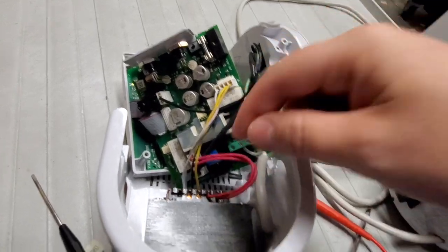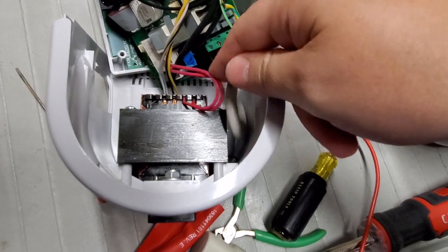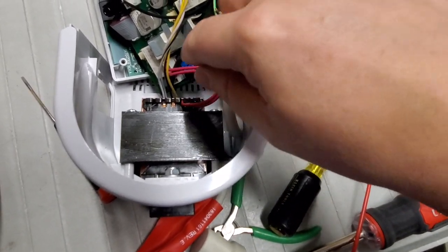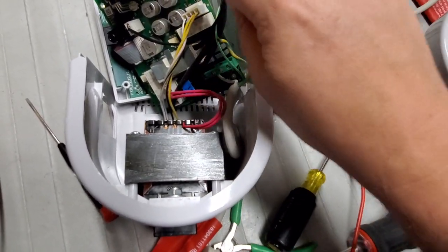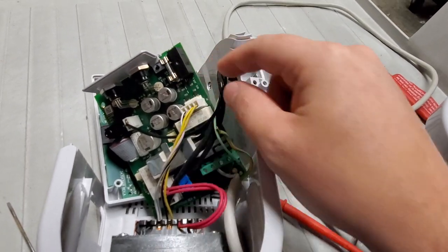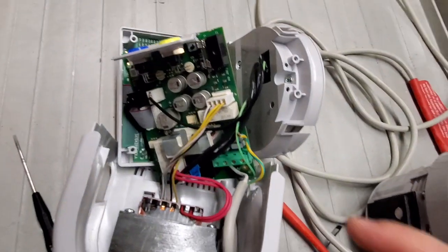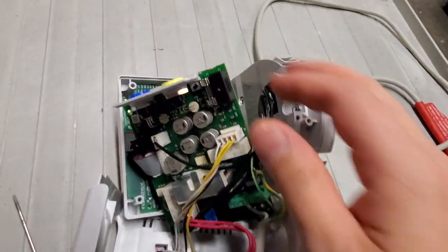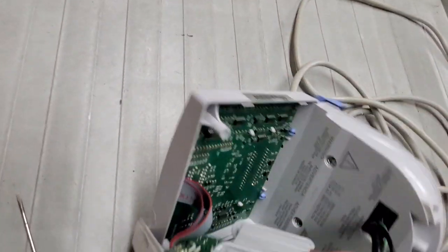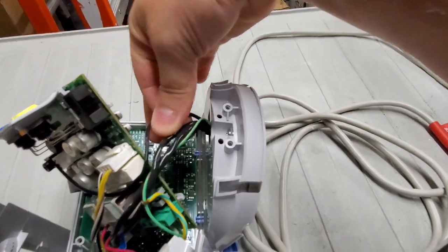Anyway, you can see that we have a step-down transformer right here, which is going to help with your isolation as well. There's multiple relays inside this board. Some power filtration. You can see that it's got a nice fat fuse under there, and your controller board is this guy over here. So this is basically power distribution and temperature monitoring, but this board back here actually does the computations. And then there's a couple different leads that run over here to the platter.